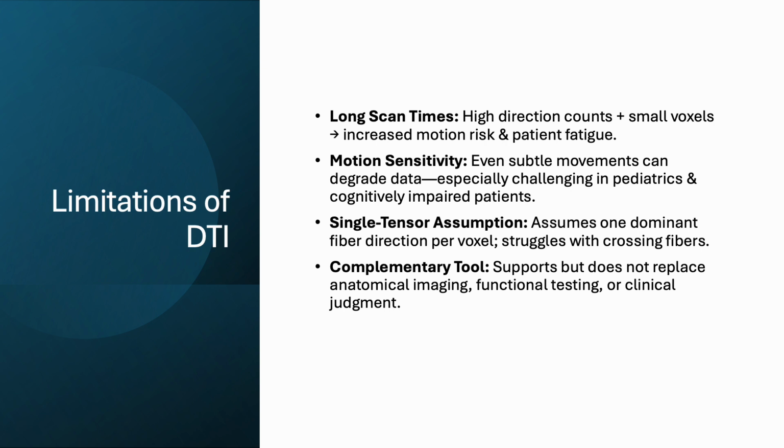Well, DTI is a powerful technique. It's important to be aware of its limitations. First, the scan times can be very long, especially if we use high numbers of diffusion directions and small voxel sizes for better resolution. These not only increase patient fatigue, but also raise the risk of movement during the scan because the patients get tired. DTI is extremely sensitive to motion, so even minor movements like swallowing or a small head shift or even repositioning of the head can introduce artifacts and compromise the entire data set. And this is particularly problematic when imaging children or patients with cognitive challenges who may struggle to remain still and follow instructions.